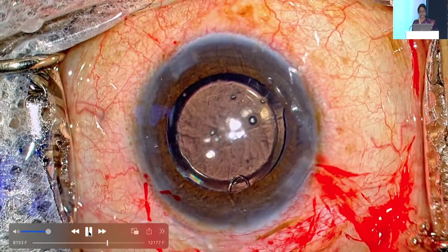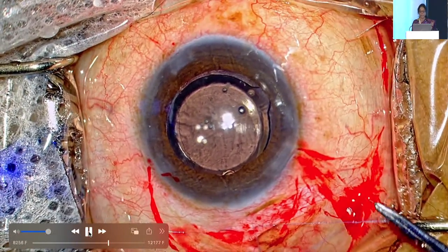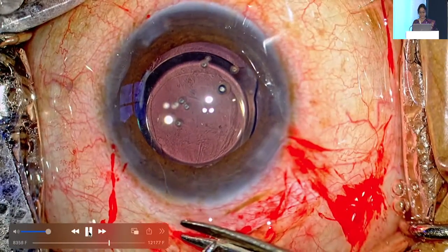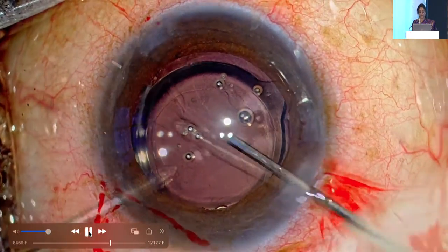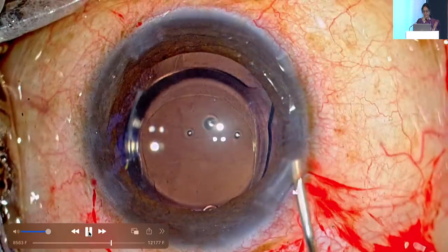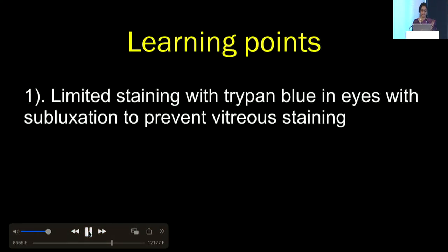now realize that sometimes we try to do too many things in the first sitting itself. Deferring surgery to the second sitting, planning and trying to get everything in place would always be helpful, beneficial to the patient as well as the doctor. So here I get a clean cortical removal, and this is how the patient did.